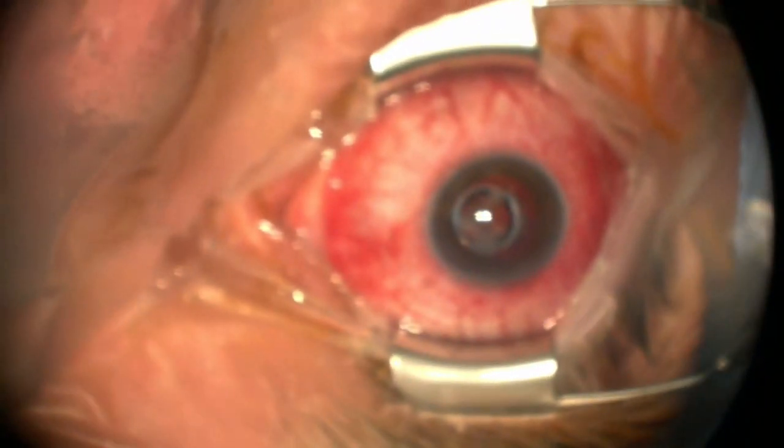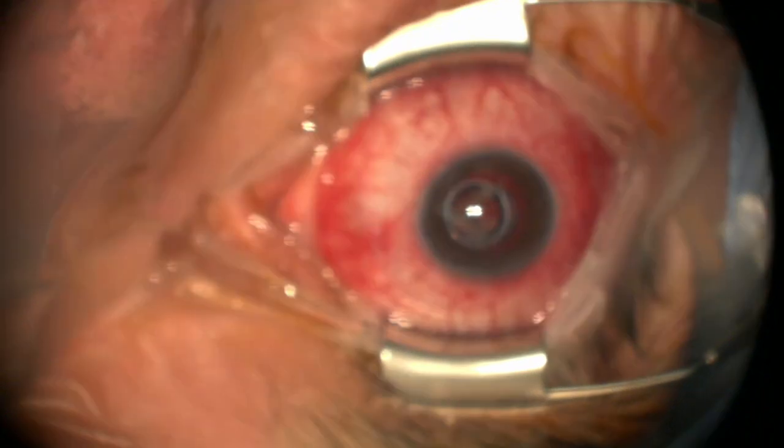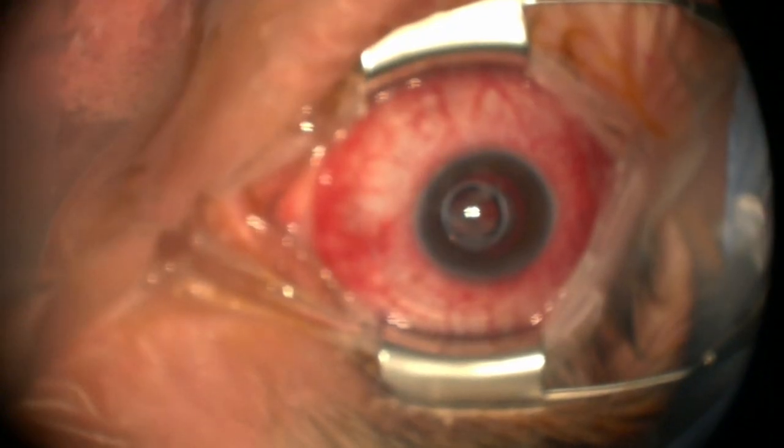Yeah, Jenny just mentioned she sees an oil bubble in the anterior chamber. Commonly, oil will migrate to the anterior chamber. We are going to take that out for you too and show you how we do that. So like I said, this case, a little more going on than the last one.